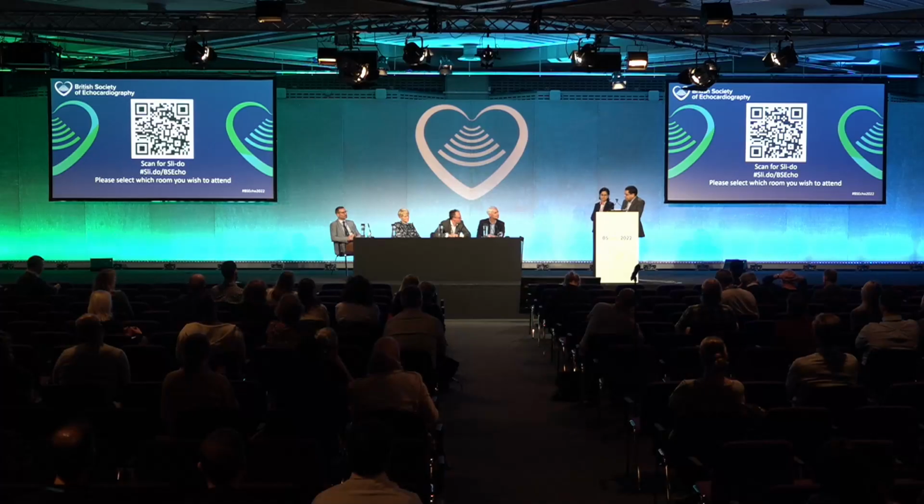Although I'm very skewed because I like echo, I would say that personally I think the calcium score is useful if it's very, very high or very, very low. But there are a lot of people in the middle, and you should take it with a slight pinch of salt. So I would use it very cautiously, if everything else doesn't give you the answer. That's where I am.